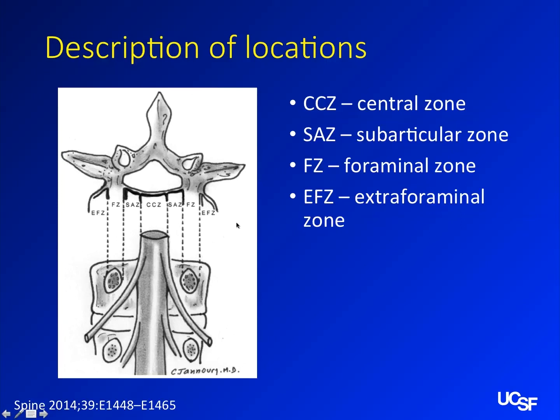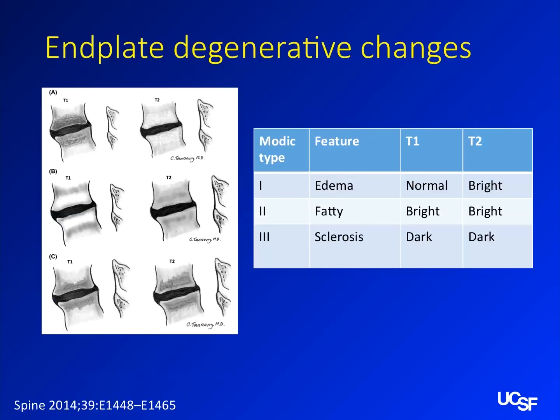Endplate degenerative changes — endplates can look awful. They can enhance and have a lot of abnormal signal just from degenerative disease. Mike Modic, a neuroradiologist at Cleveland Clinic, basically described these findings where endplates gradually change over time. Suffice it to say: you have edema first, then it becomes fatty, then it becomes sclerotic. Edema is bright on T2, fat tends to be bright on both sequences, and by the time it gets sclerotic, it's dark on both.